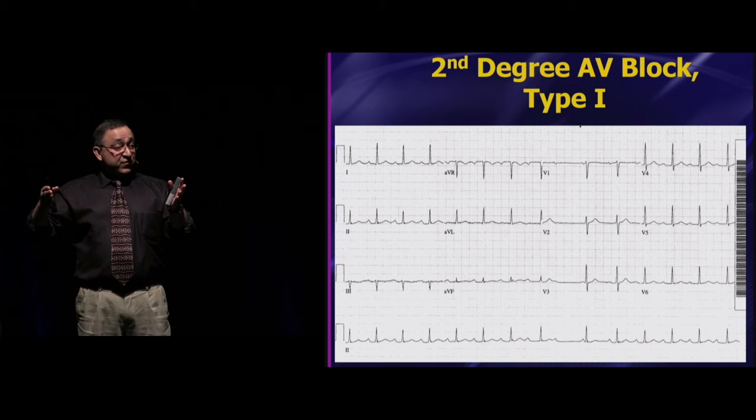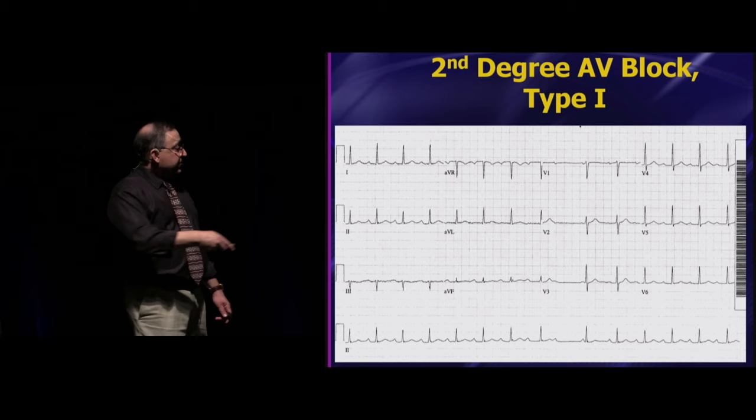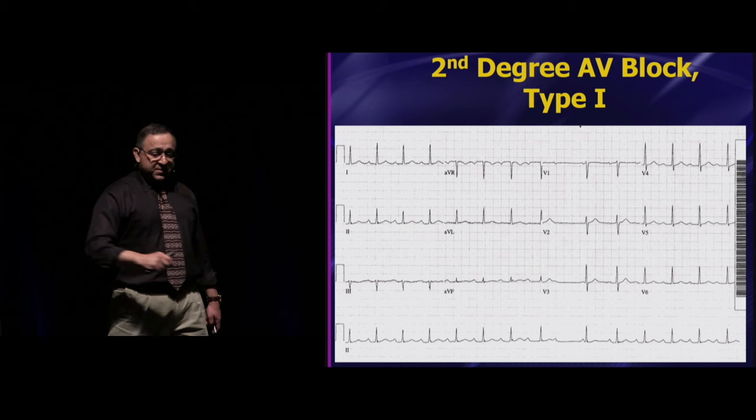And also, if you use calipers and map the P to P interval all the way across, this is completely regular all the way across, including the drop beat. All right, everyone okay with that? Okay, Mobitz 1, piece of cake.